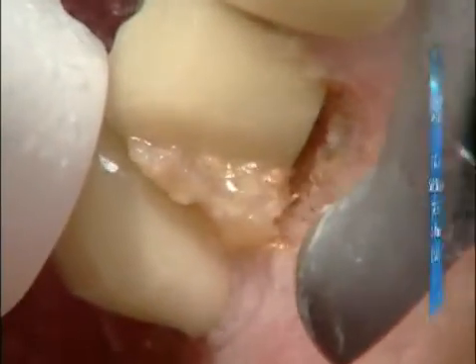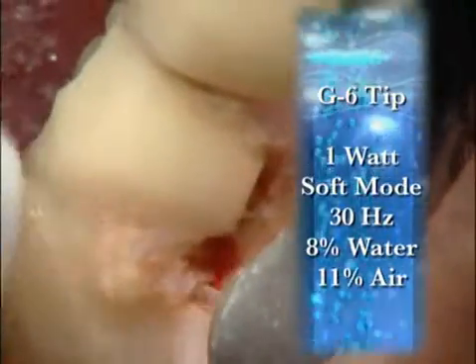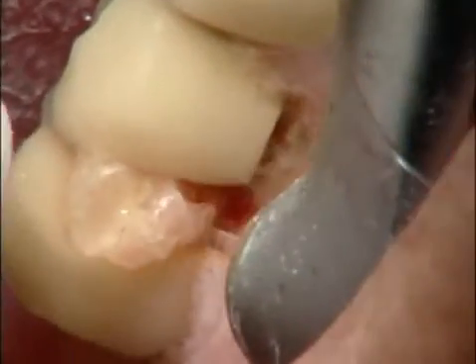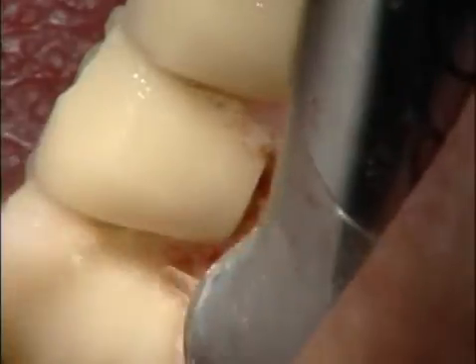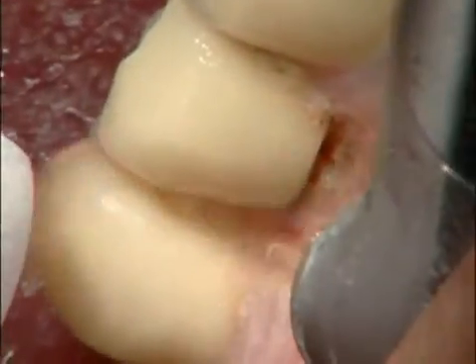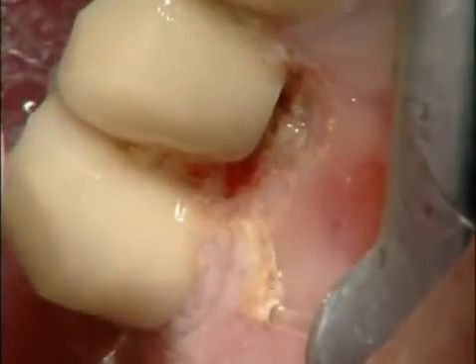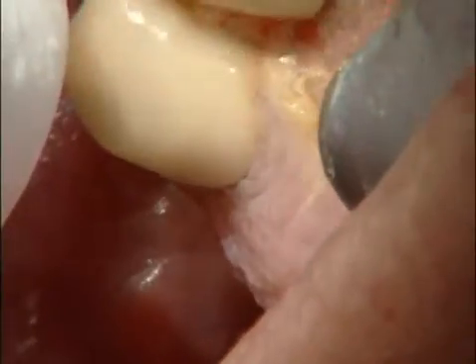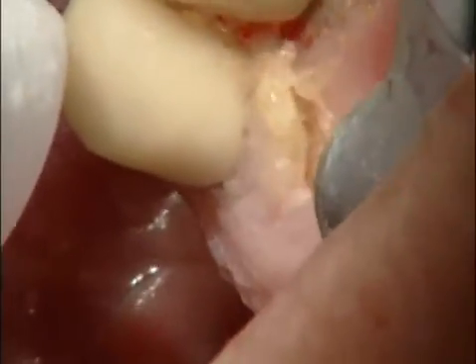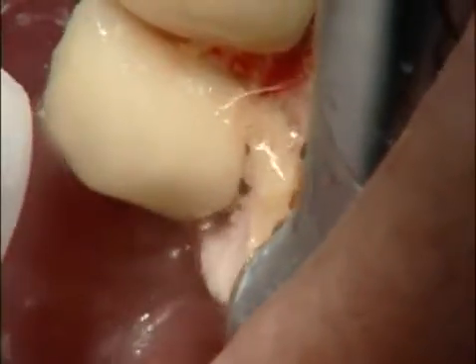So I'm at 1 watt in the soft mode with a G6 tip, 30 hertz, 8% water, and 11% air. This is a recurrent keratotic tissue. If I don't remove it 2 to 3 times a year, it envelops her teeth, pushes its way into her tongue space.